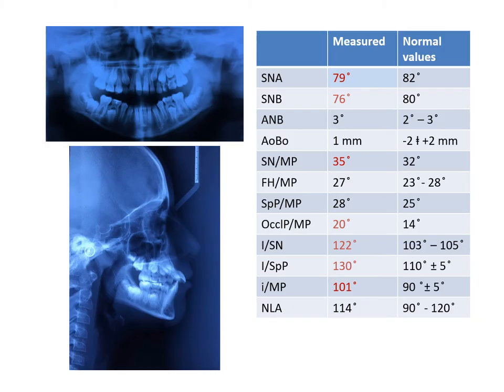On the panoramic X-ray, you can see the mesial inclination of upper left canine and two premolars. The canine goes over the lateral incisor. I decided to extract these three primary teeth, primary canine and the two primary molars. From the cephalogram, we can see that she is skeletal class 1 with a hyperdivergent type of growth and really severely protruding upper incisors.